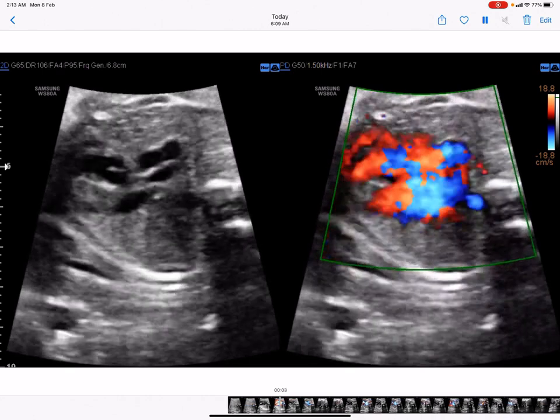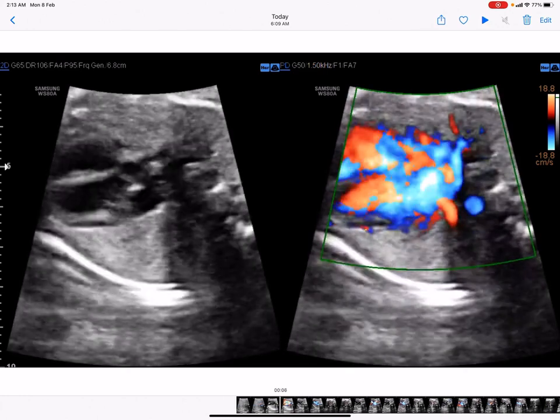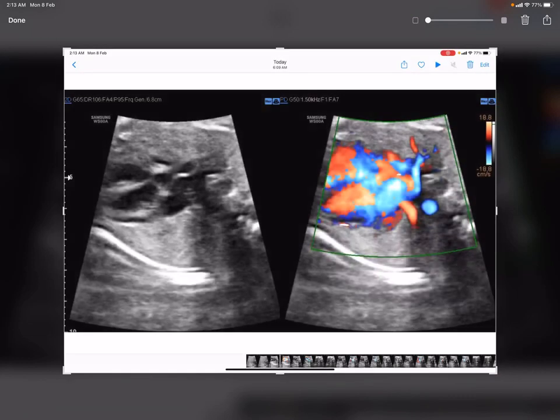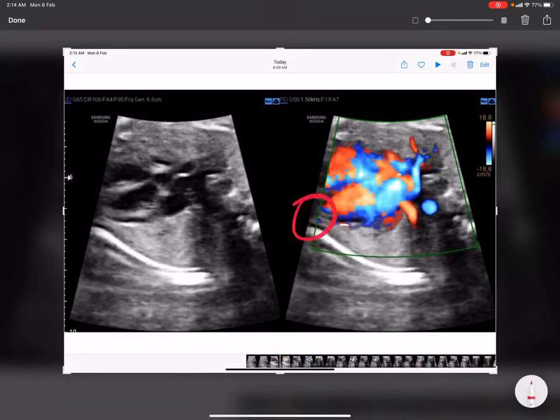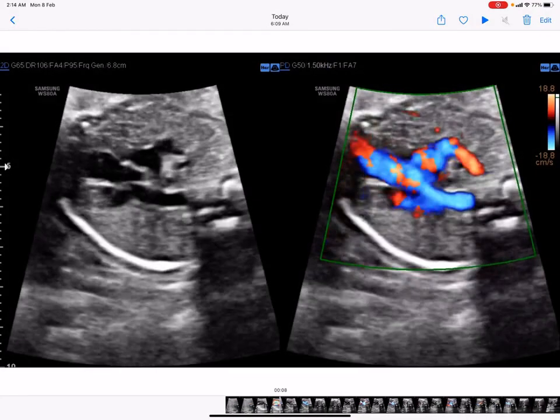Now we have to look at a vessel. Okay, so this is the apex of the heart. I hope you can see. This is the apex of the heart. These are the pulmonary veins. Okay, this is the apex. So this is the left, and now we have to look for a vessel which will come out of the aortic arch and move towards the right shoulder. Okay, because this is the right side. So this is how we do it in day-to-day practice. Okay, so this makes things very easy.